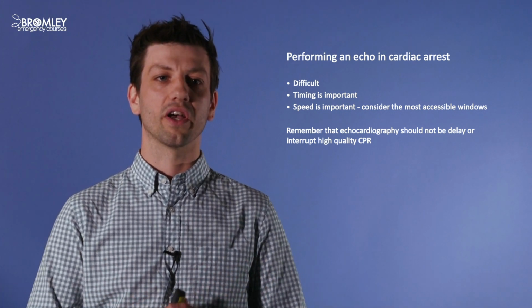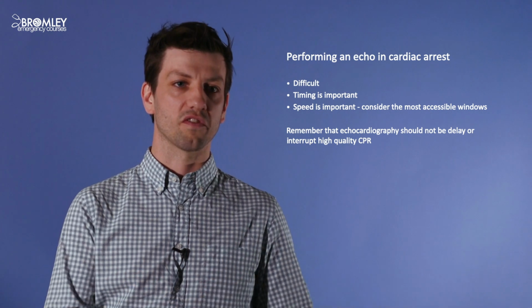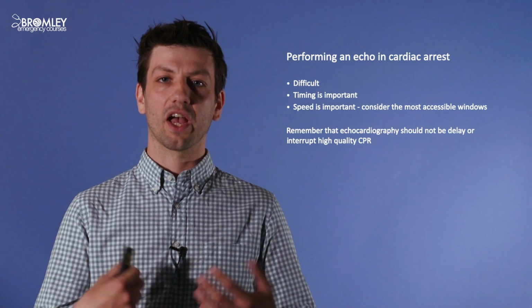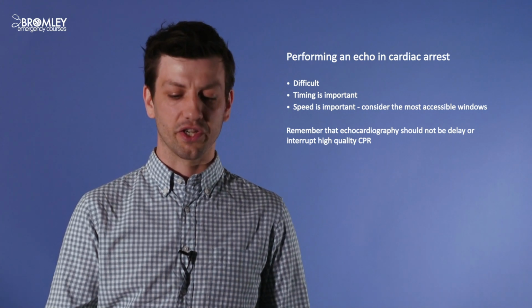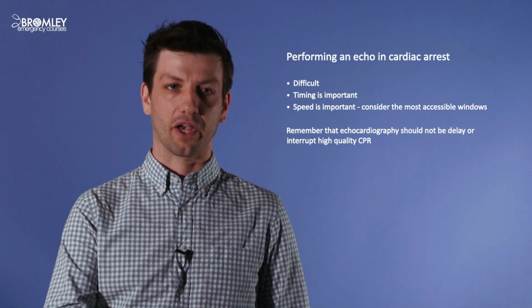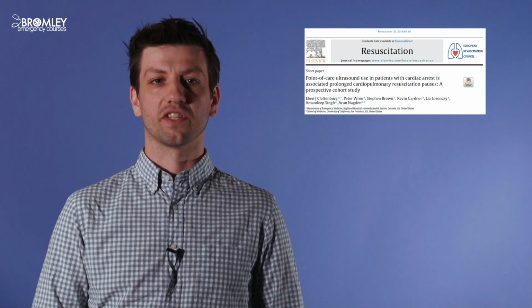We know that a cardiac arrest is a high octane environment. There are lots of people in the room, there are lots of emotions in the room, and it can be very difficult not just to access the patient, but to perform an echo within a 10-second pulse check. And we know that echo delays the resumption of CPR.